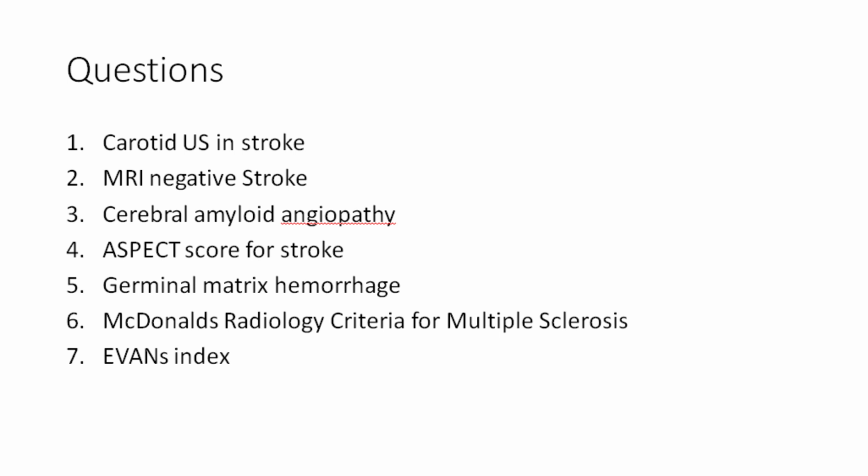And in most of the stroke centers where high-end imaging is not available in the US, it's the same thing. We think they are rich. They are rich, but not everywhere. They do ASPECT scoring just on a CT scan. Even on CT scan, there is no MRI. And you say, this patient is candidate for treatment, for TPA. He's not going to bleed because it gives you the extent of damage.